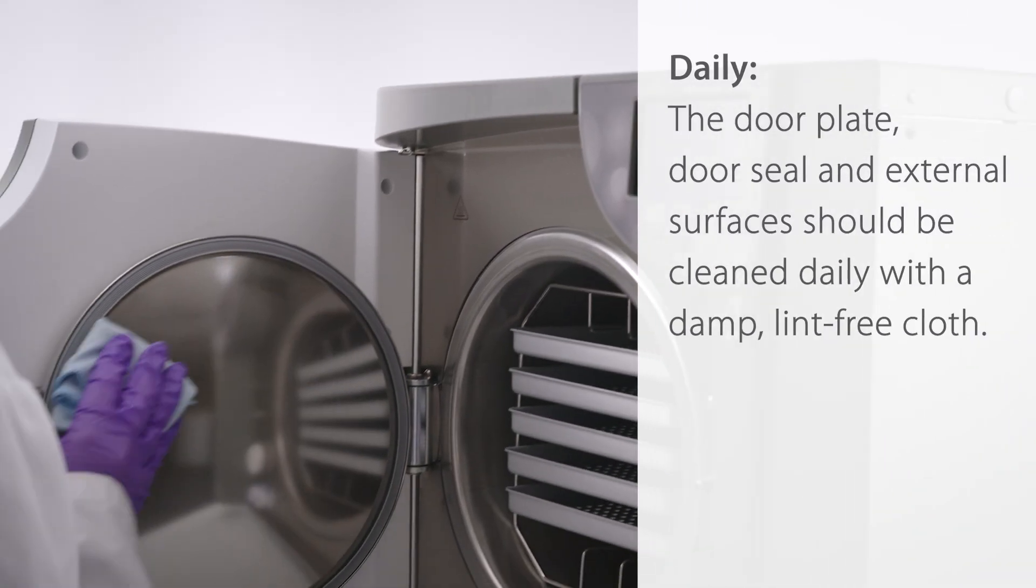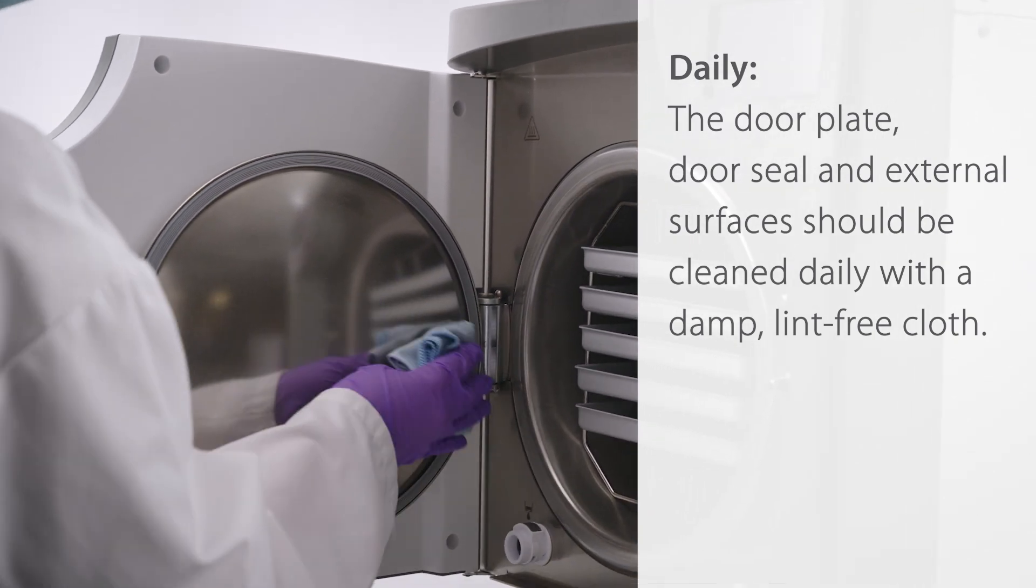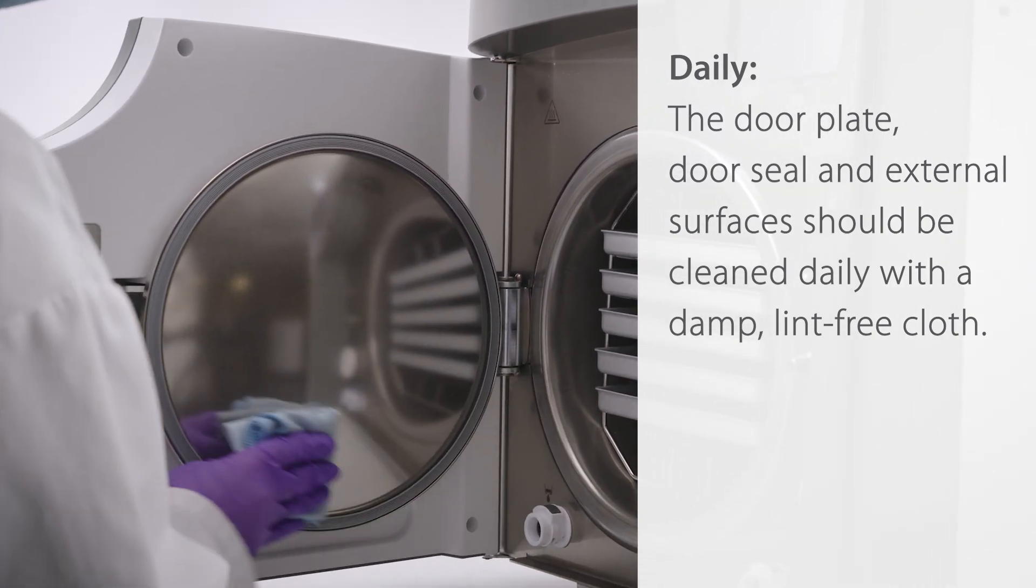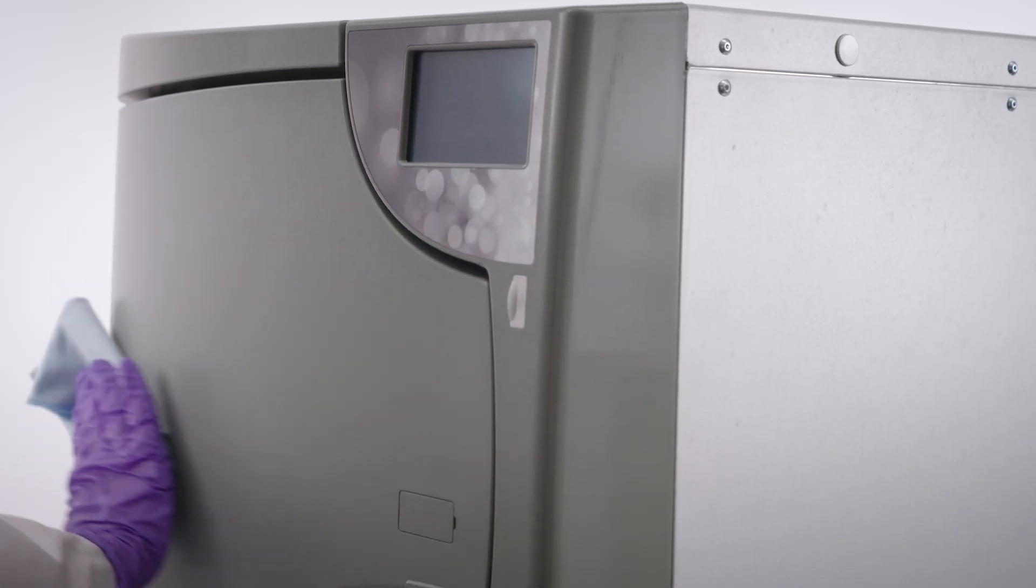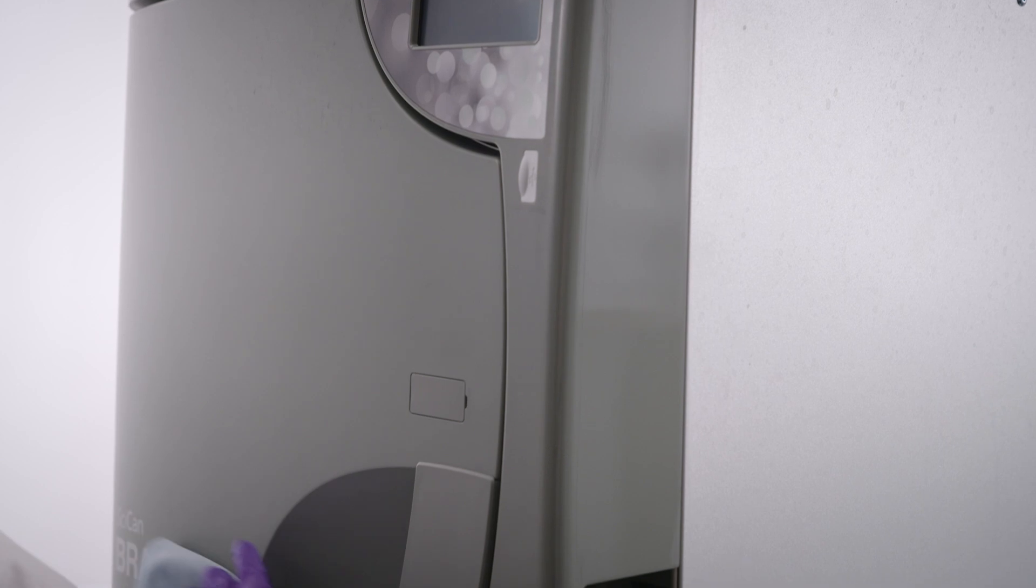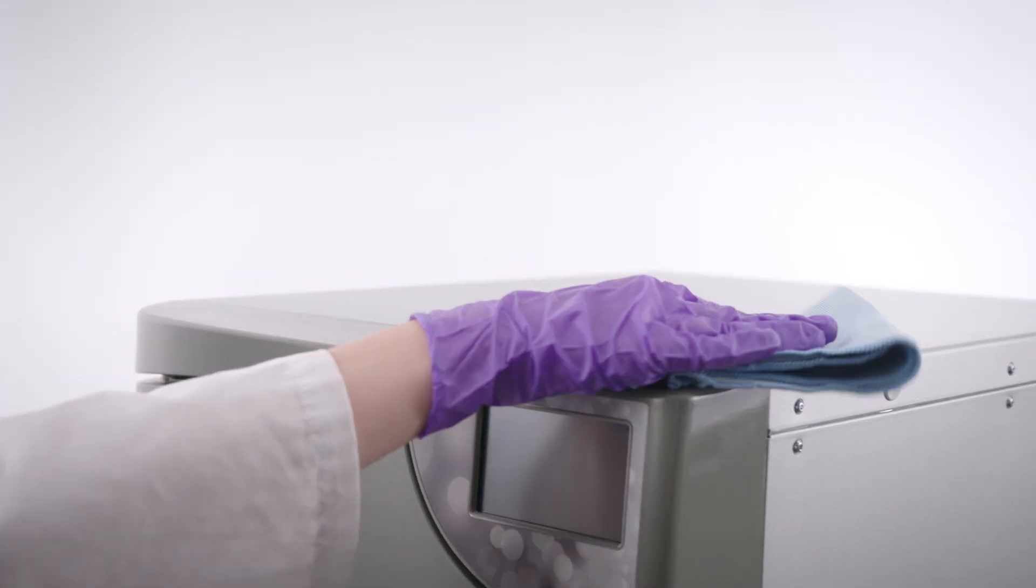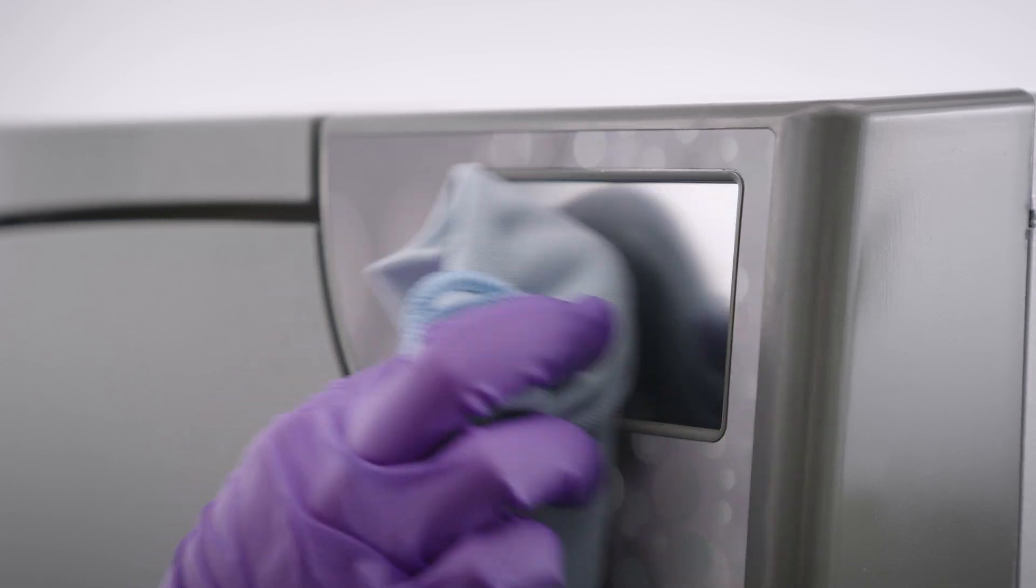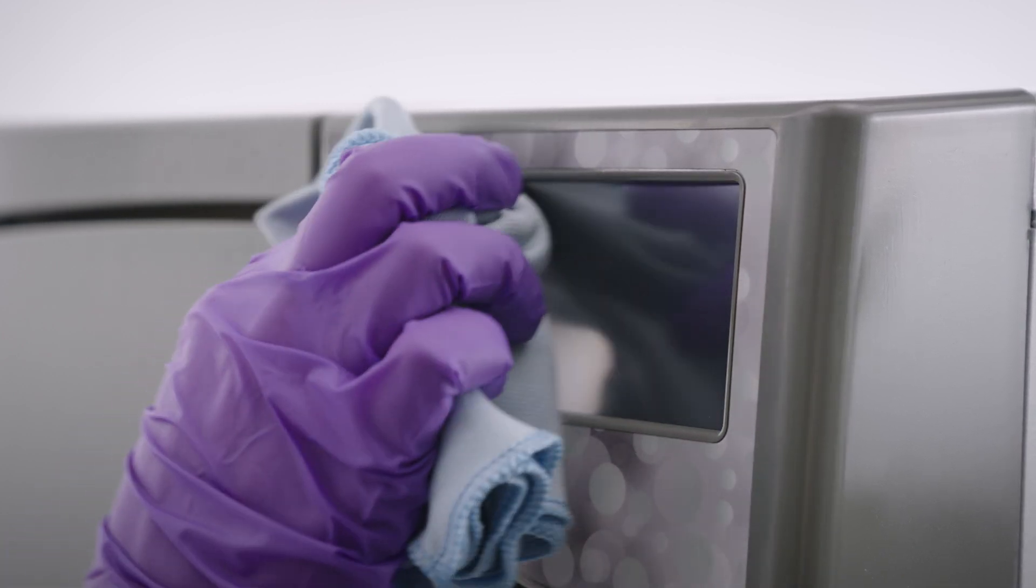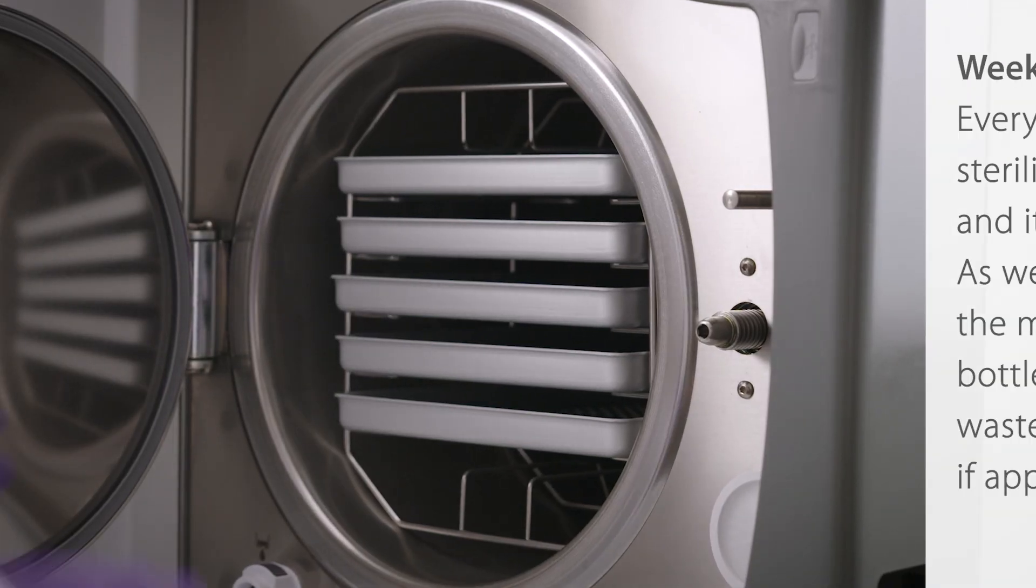Daily, the door plate, door seal, and external surfaces should be cleaned with a damp, lint-free cloth. Clean all the Bravo G4's external parts using a clean, lint-free cloth dampened with water and, if needed, a mild detergent. Dry the surfaces and remove any residue before powering the unit on.